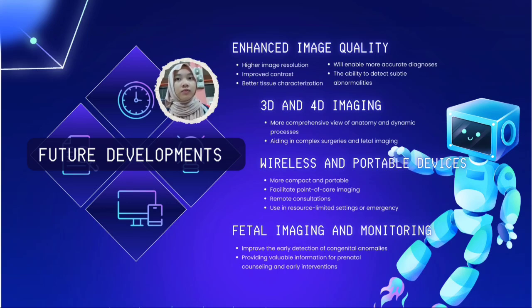Second, we have 3D and 4D imaging. 3-dimensional 3D and real-time 4D imaging will become more commonplace in clinical practice. These technologies offer a more comprehensive view of anatomy and dynamic processes, aiding in complex surgeries and fetal imaging during pregnancy.